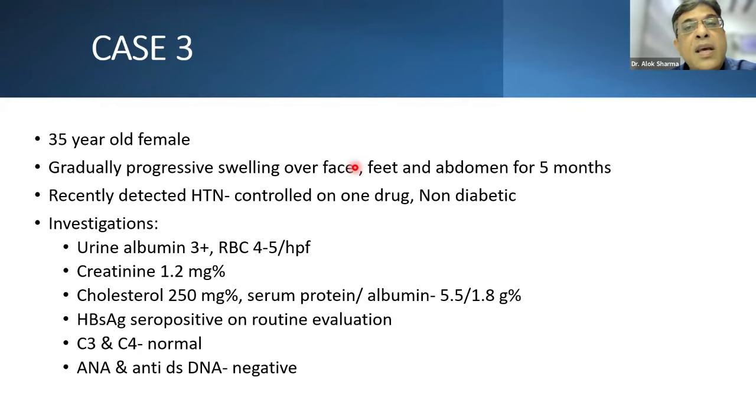The same pattern can have multiple etiologies. Like for membranoproliferative, there can be 15 etiologies. For an FSGS, there can be so many etiologies. We just saw that, right? So it's important to understand, note and document the patterns. And then in what context that pattern is arising needs to be figured out by a combined effort of the pathologist and the clinician.